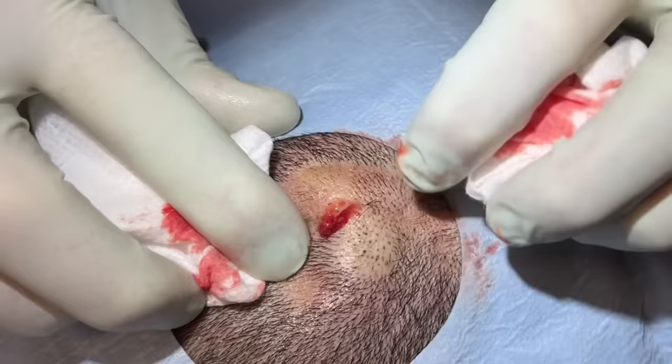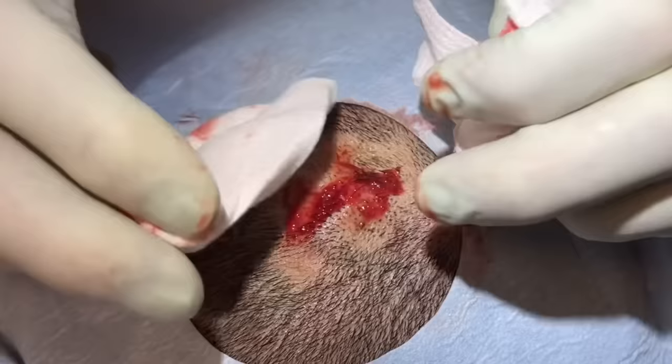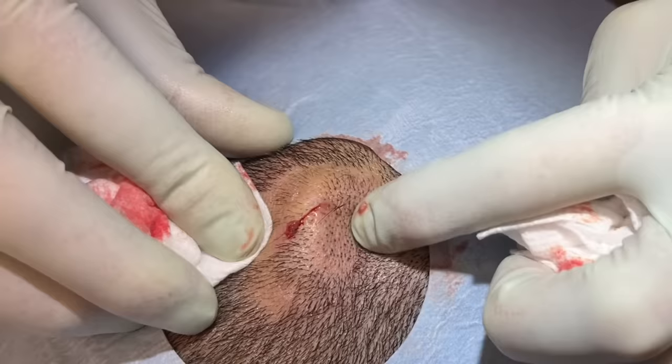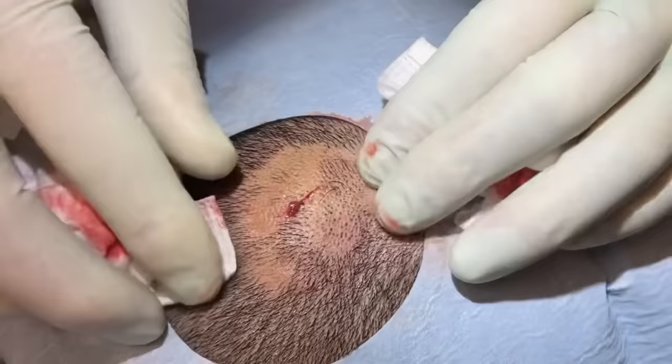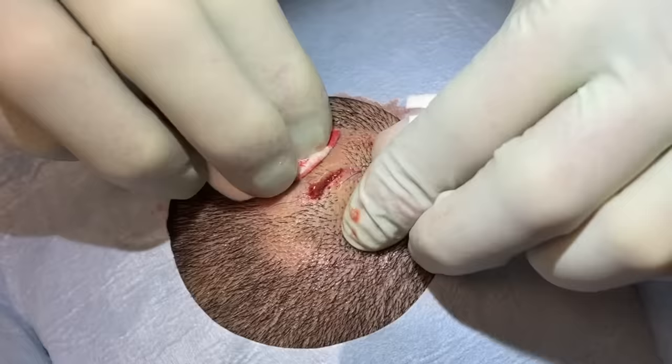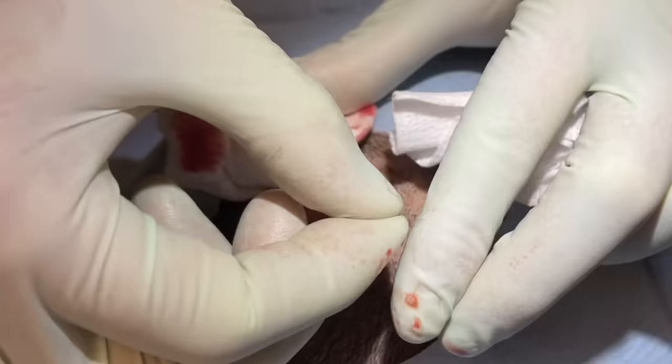So last bit — he's tender right there on this side. The more I get out, the longer this will stay flat for you. So if you can handle it, I'm just pushing from different angles. He even had a small one starting here that's attached — you can see it's drained right into there and that one's flat too. So that's good. Once we start getting a little bit of red blood like that, that means we're at the bottom — that's how we know. You can see how raised up that was; it is flat now. I think I see another hair right here — another curled up, big grouping of hairs in there.